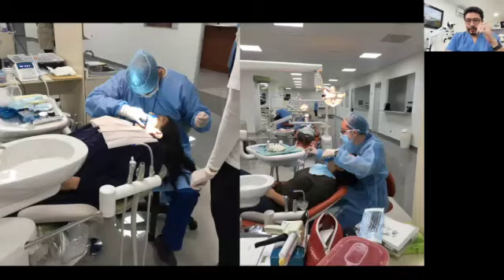And they are just trying to reduce the focusing distance for having a proper vision of the operative field. And this is a story that is repeating every day all over the world with all the dentists. So we need to avoid this because this will generate musculoskeletal disorders that are going to affect you. And we do not want this.